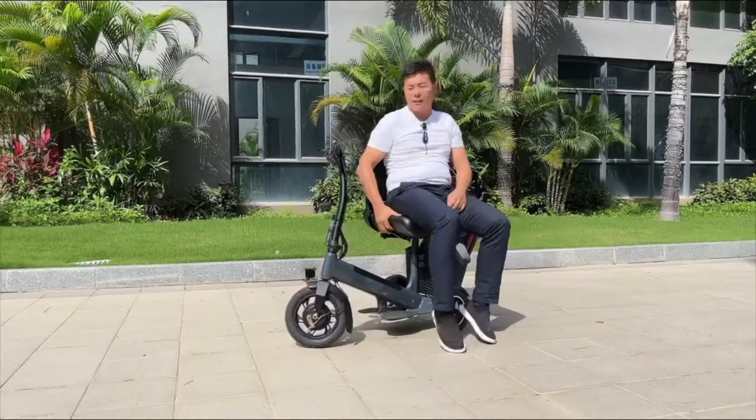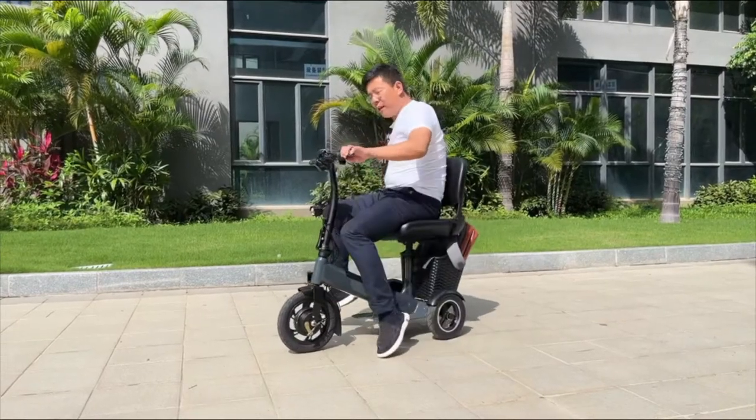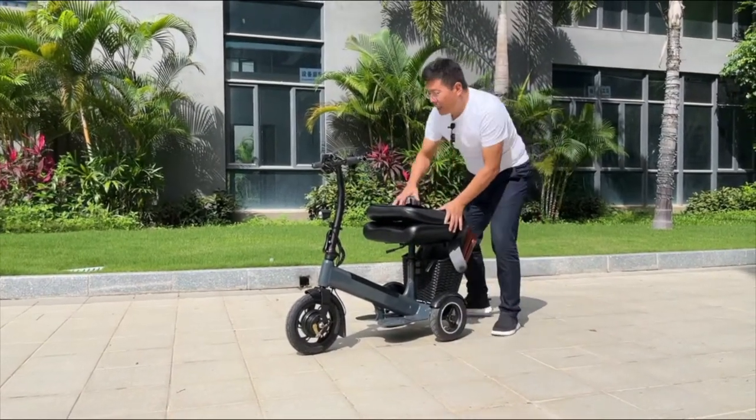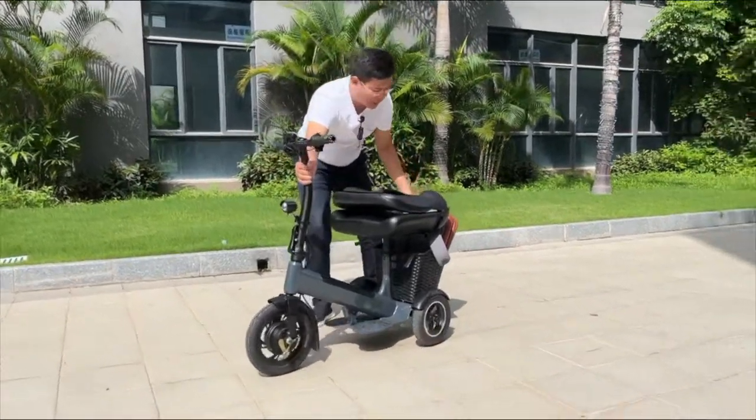It can also turn like this. It's very convenient. The seat is like this, and it has front lights and two lights.